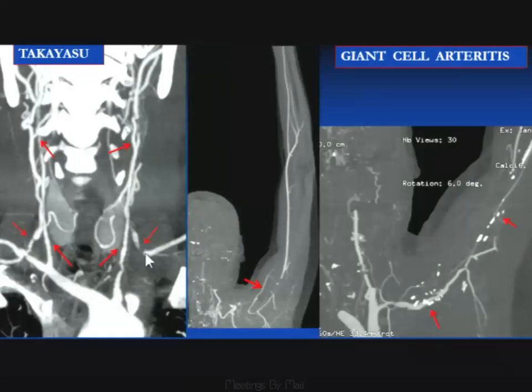This is a vertebral artery origin, and indeed there's more disease at that vertebral artery origin. And then here's the subclavian. Beyond that, we have again a focal disease process in the distal axillary. Beyond that, though, the vessels are relatively normal. We could follow those down to the distal upper extremity.